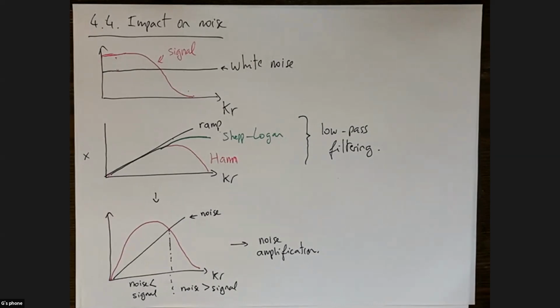Hi, I did have a question about the filtered back projection, or sorry, the ramp filter. You were saying that part of the benefit is that you can compensate for the too many low frequencies, and so you're trying to de-emphasize them to decrease the blurring. But that doesn't really have anything to do with the actual resolution, does it? You couldn't do a sharper ramp that goes like parabolic to make it even more high frequency?